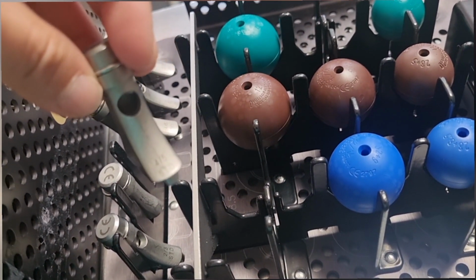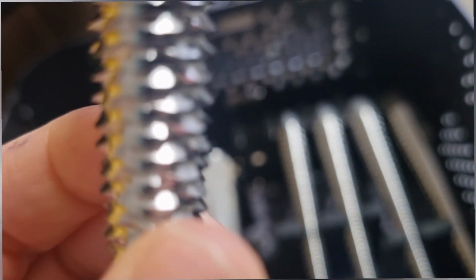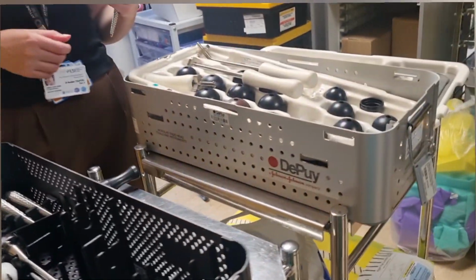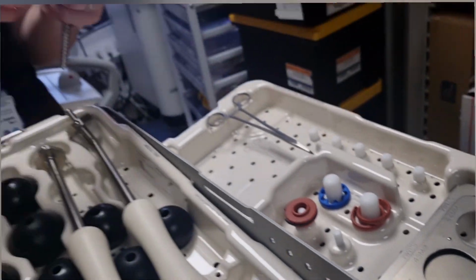Standard. Because these ones are, so that's 1, 2, 3, 4, 5. So it'd be one or the other. And then if you're doing a hemi, you'll just have your head and your spacer.